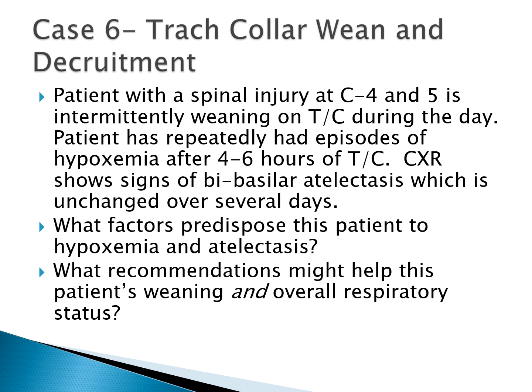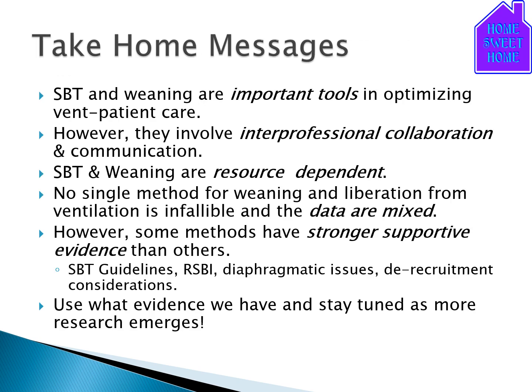And they end up, maybe their best version of themselves is they end up only needing BiPAP at night, not so much for obstructive sleep apnea, but just to keep them from developing atelectasis and to keep them from retaining too much CO2, particularly at night, because all of our respiratory drive will reduce at nighttime, but when someone has no reserve, such as a patient like this, it can be even more problematic. So they should be considered to be extubated to some form of non-invasive ventilation, and then eventually, considering weaning them off of that.